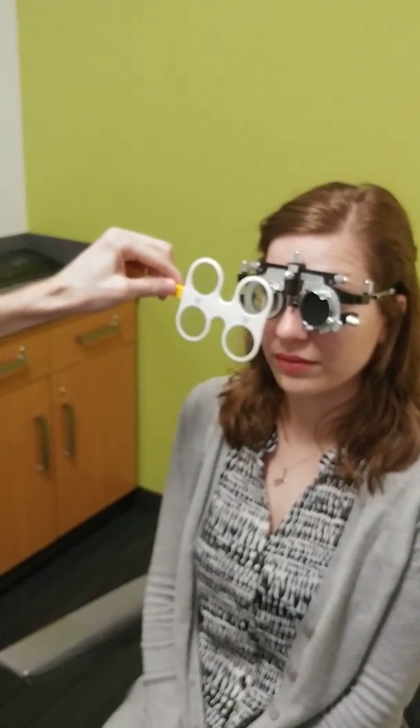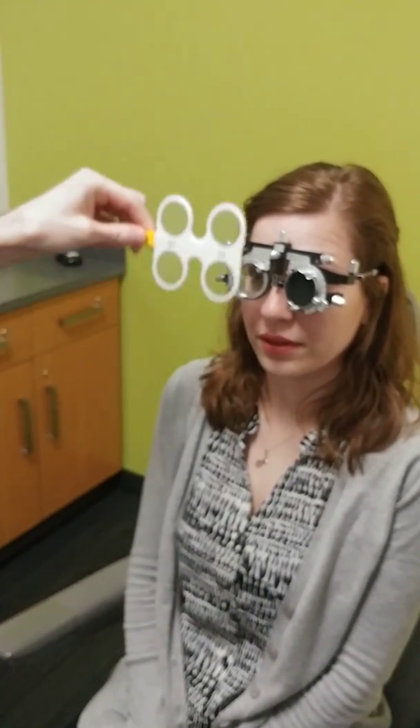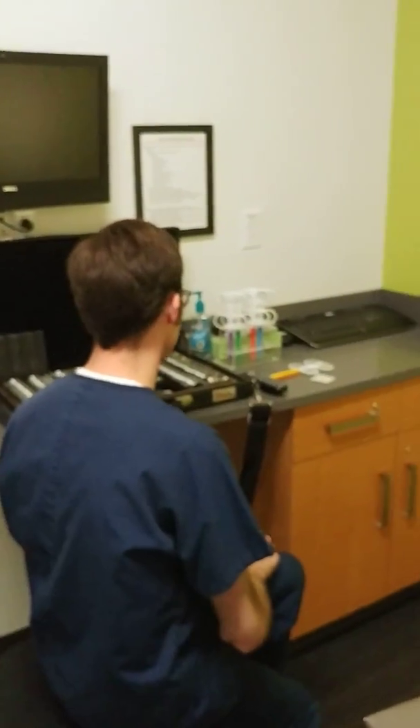More clear with the lens or without it? About the same. More clear with or without? With, just a hair — pretty close. If it's pretty close, I generally go ahead and move on to checking the cylinder.